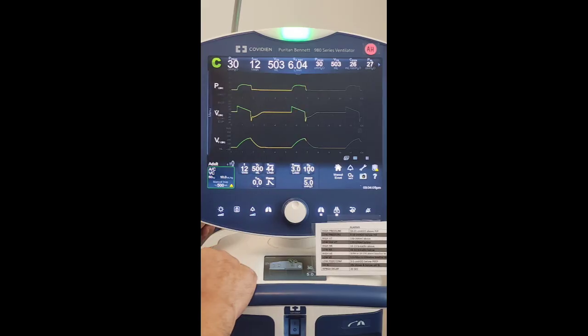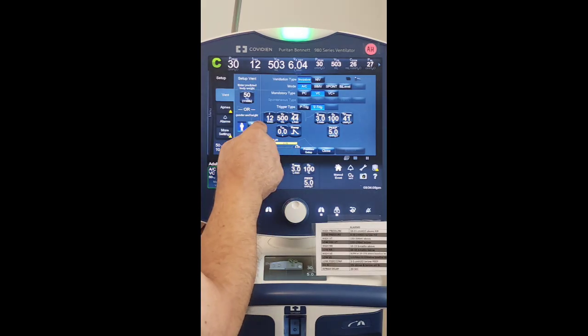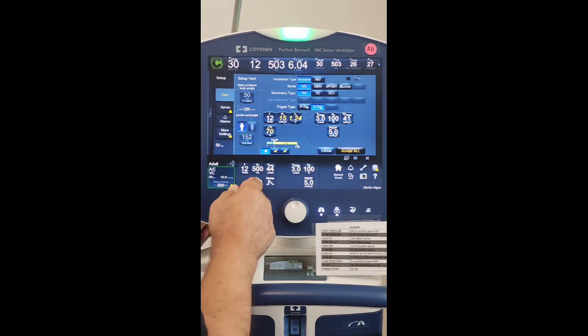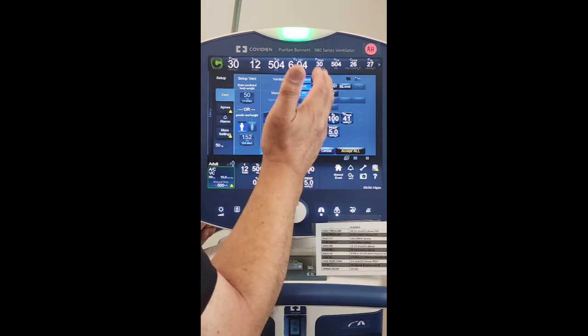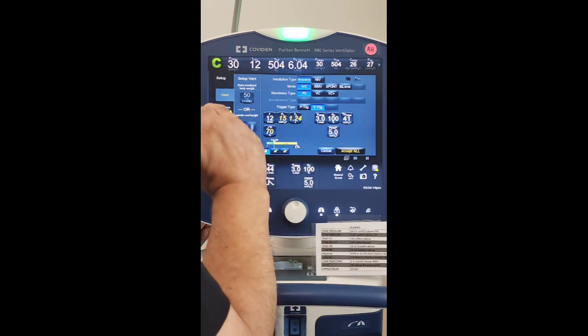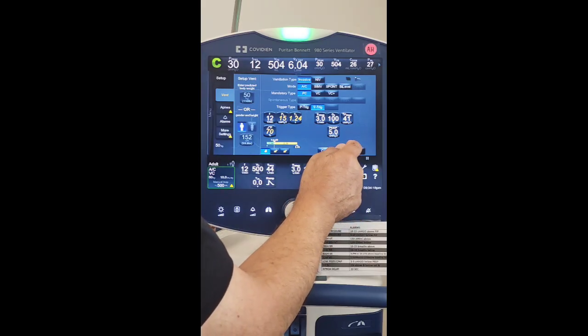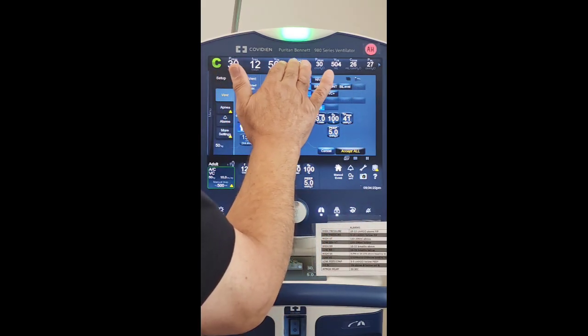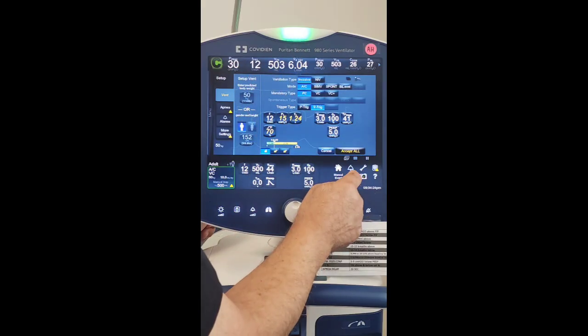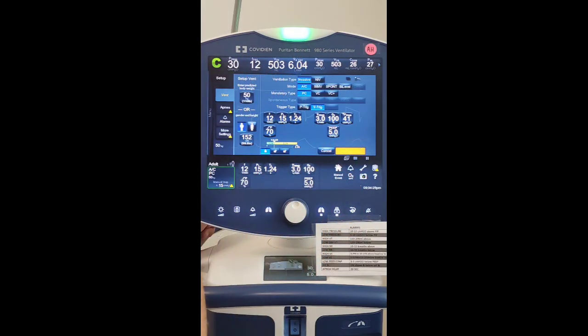Let's go back in here. So that's it. I waited too long. We're in pressure control, 15, everything is good there. I'm leaving PEEP as it is, FiO2 the way it is. I'm going to go ahead and accept it. Okay, remember the numbers up here. I'm going to show you right now. Tidal volume 500, minute ventilation 6.04. So here we go, accept.